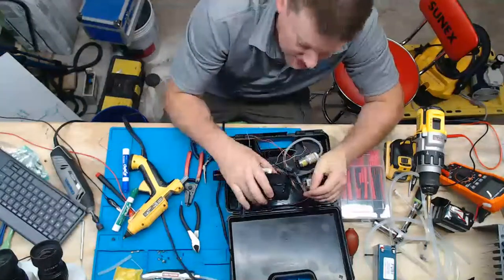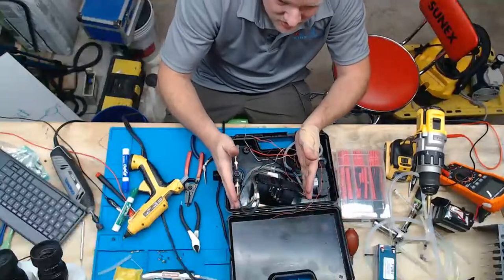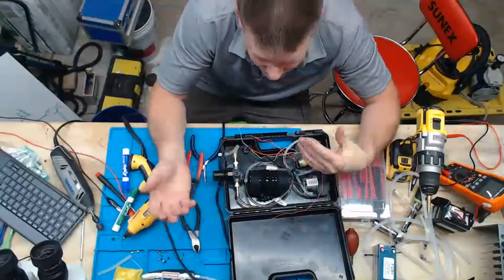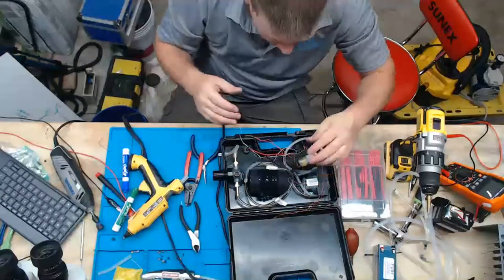But this is absolutely necessary, because you want to have some sort of pressure reservoir between your pumps and your regulator. All right. So it is what it is. I don't have a rigid reservoir at this moment. I could probably make one, but why? This works fine. So that's where I'm at, guys.